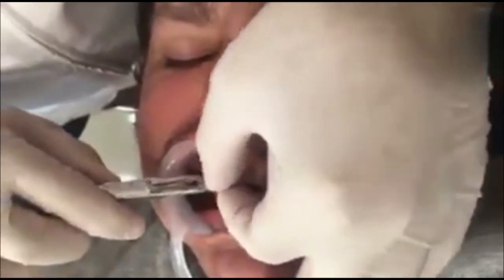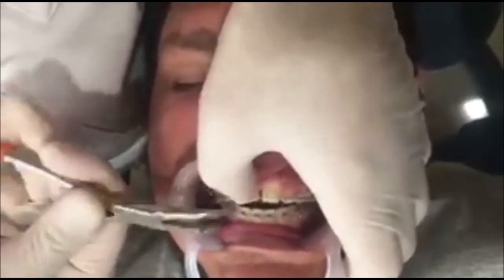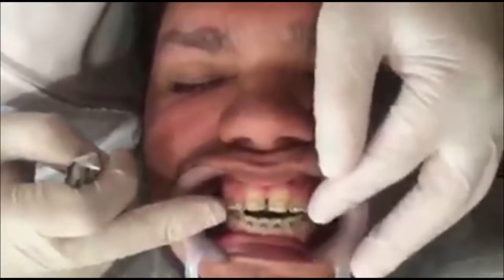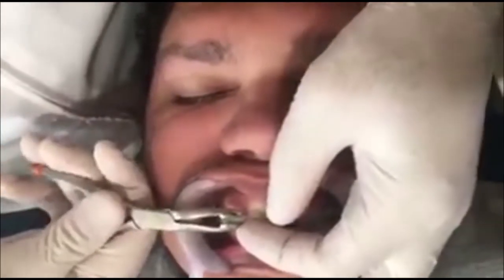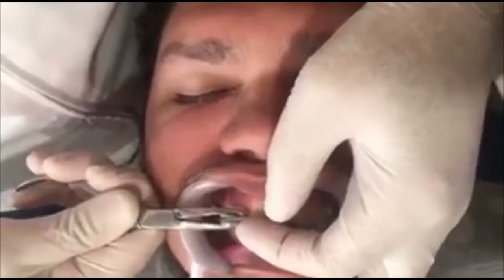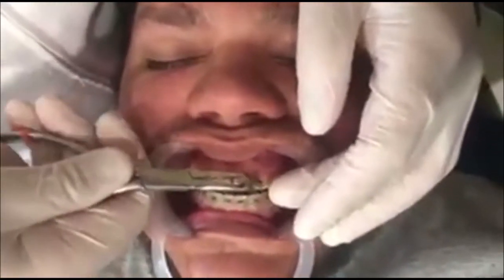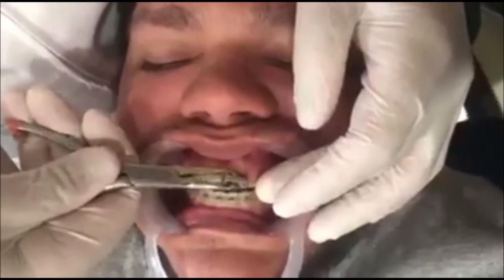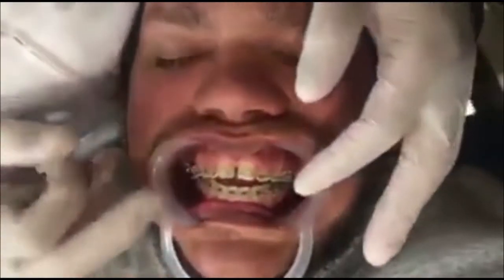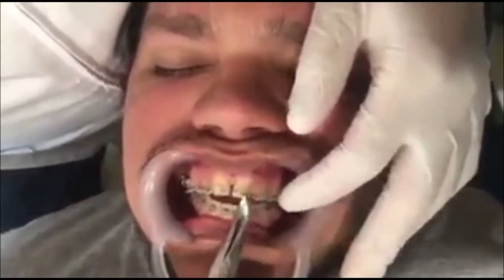This cantilever will help to close the anterior open bite — the patient will feel his front teeth pushing down slightly. Because the MRP in the back provides anchorage, there will be no side effects. You can see the patient shaking his head, meaning he feels pressure on his front teeth.